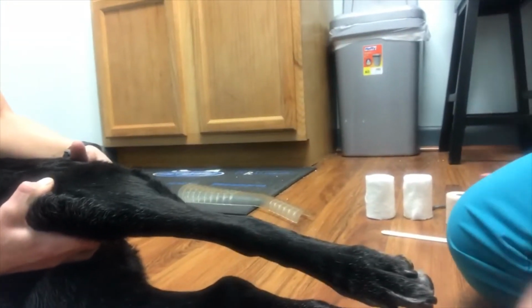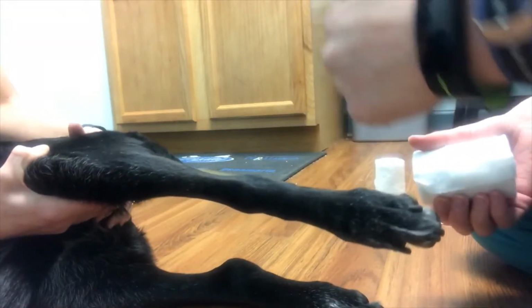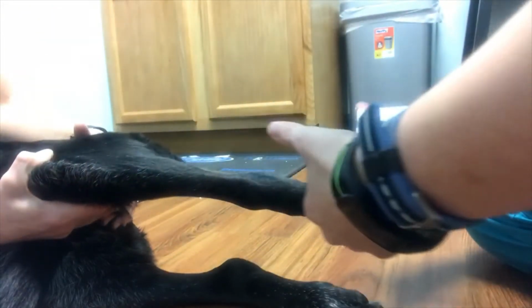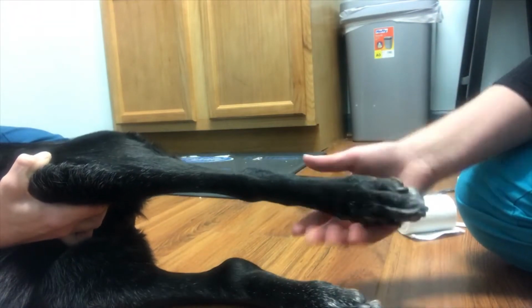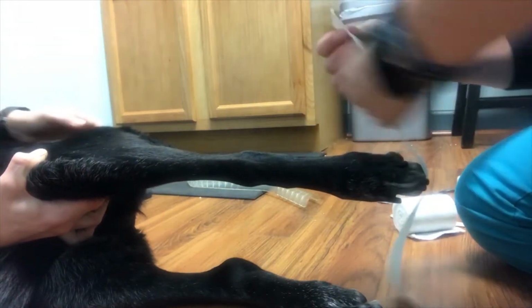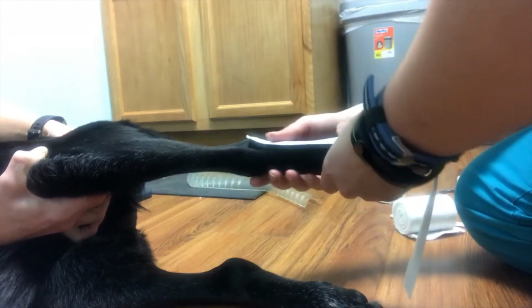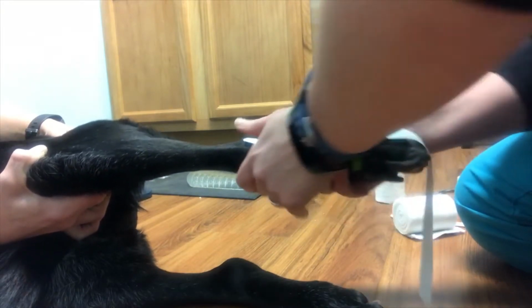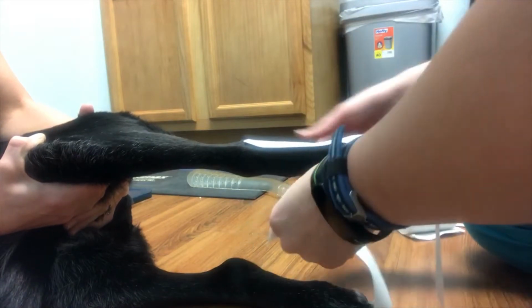An important thing to remember when you are placing any sort of bandage is you want to start distal and move proximal. The reason for this is you don't want to go proximal to distal, because any fluid could potentially be trapped at the bottom. After placing the stirrups: when you're placing the stirrups, these help secure the cast padding and the layers of the bandage, so that they don't slide down the leg.